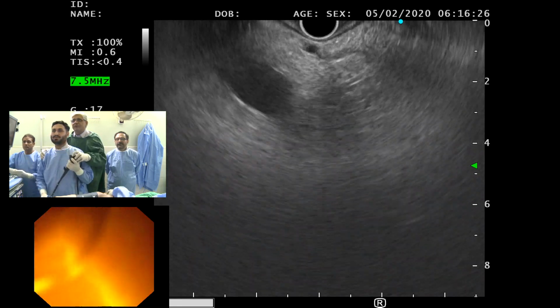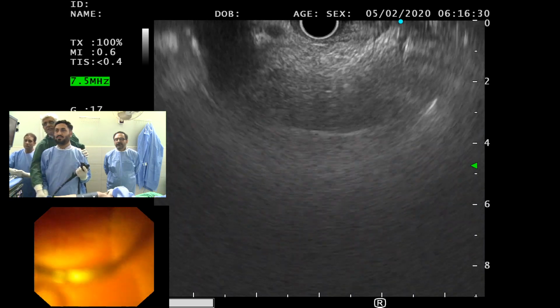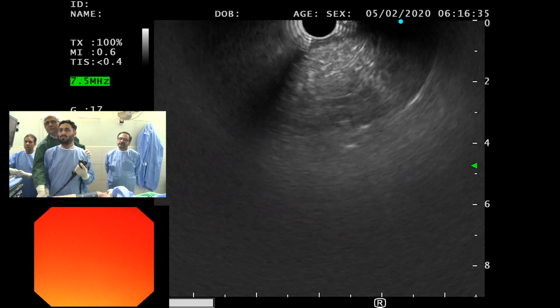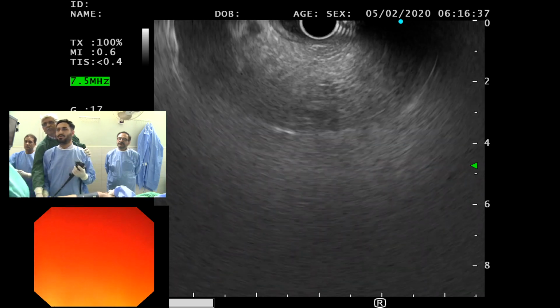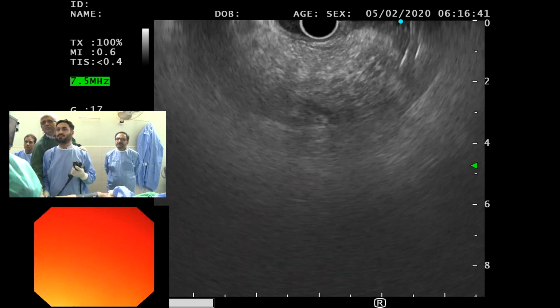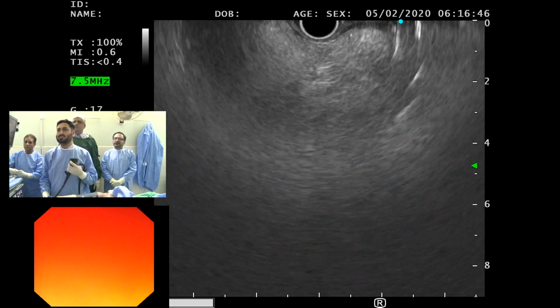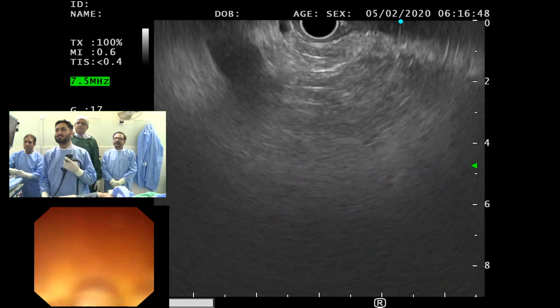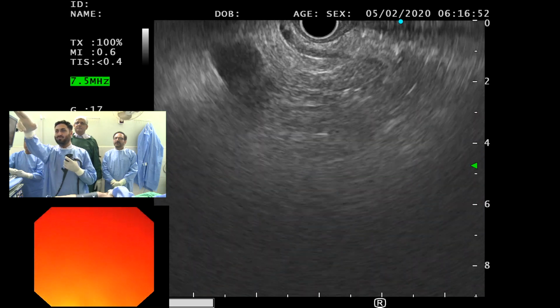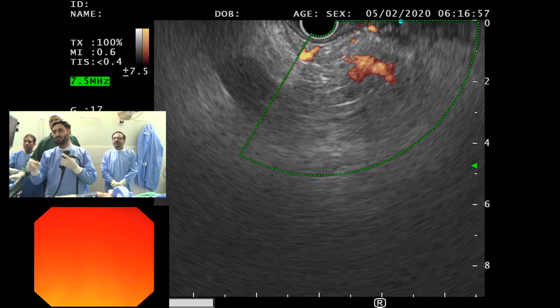But before that, we need to find out where the bile duct is. So adjust yourself by moving the scope, pulling back slightly. There you are. You saw that. It's just subtle movements that will bring the bile duct in your view. So try and do that. Tip up. Right. Portal vein is there. That's probably GDA. Yep.